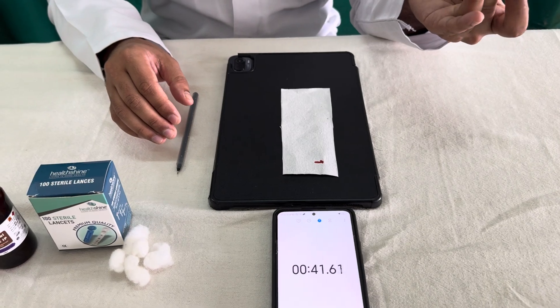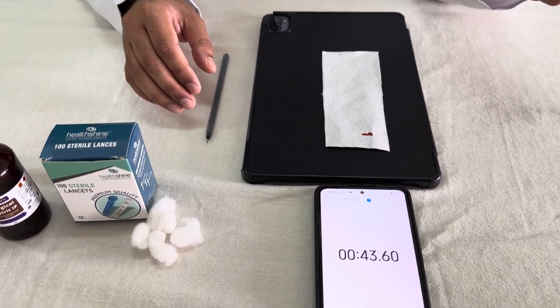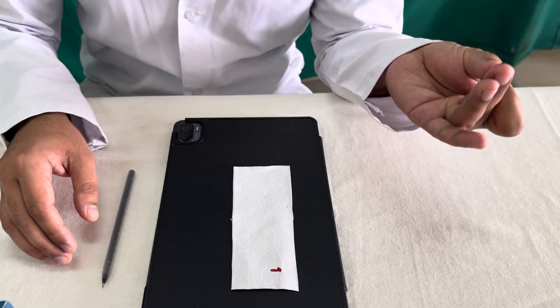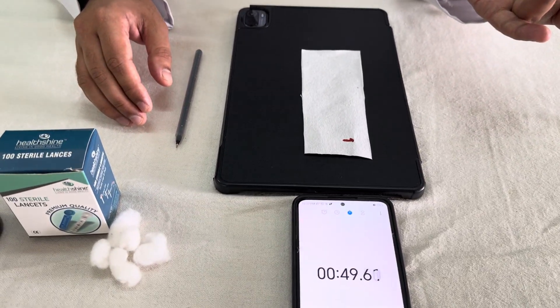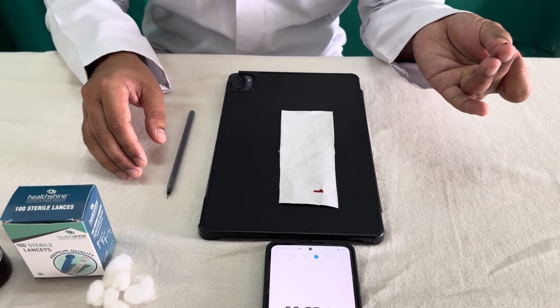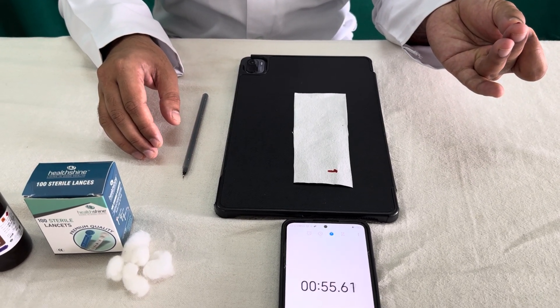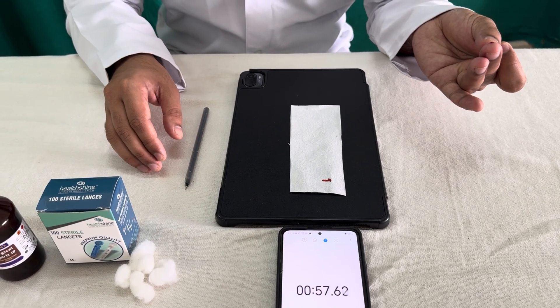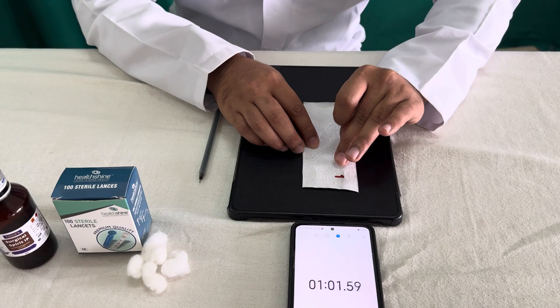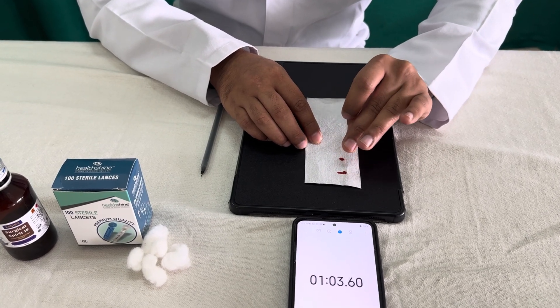After the next 30 seconds — that is 60 seconds on the stopwatch — we have to again just touch the drop of blood on the blotting paper. The precaution is you should not squeeze the finger. The blood should be freely flowing and you should just touch it, not too firmly.